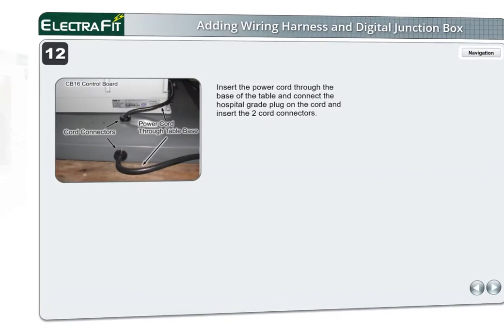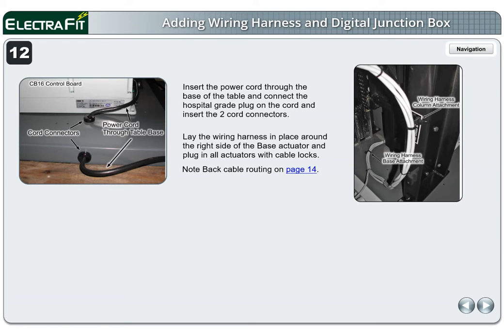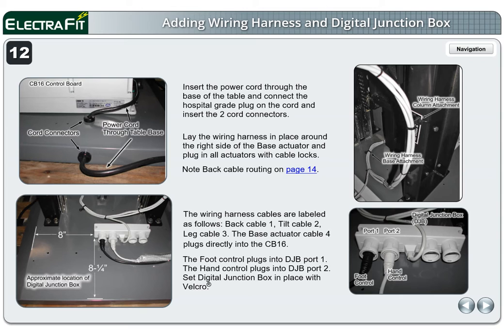Page 12. Insert the power cord through the base of the table and connect the hospital-grade plug on the cord and insert the two cord connectors. Lay the wiring harness in place around the right side of the base actuator and plug in all actuators with cable locks. Note back cable routing on page 14. The wiring harness cables are labeled as follows: back cable 1, tilt cable 2, leg cable 3. The base actuator cable 4 plugs directly into the CB16. The foot control plugs into DJB port 1 and the hand control plugs into DJB port 2. Set the digital junction box in place with Velcro.